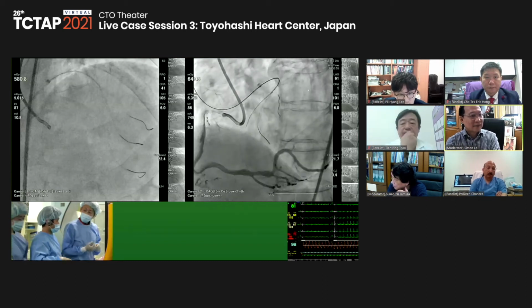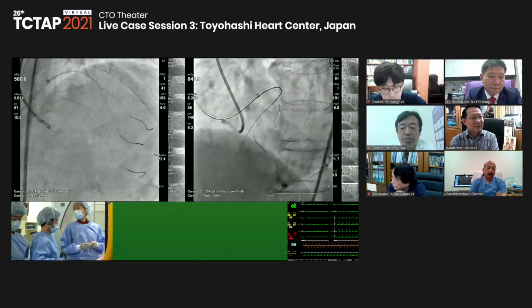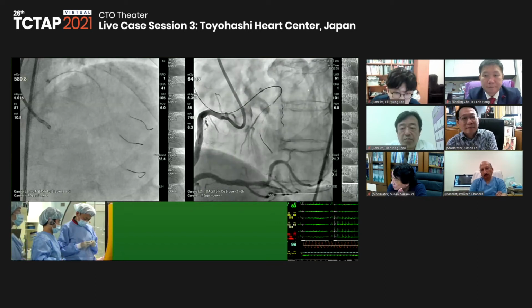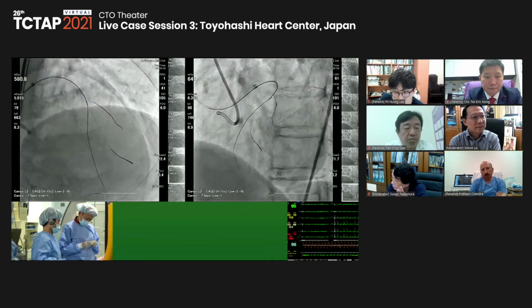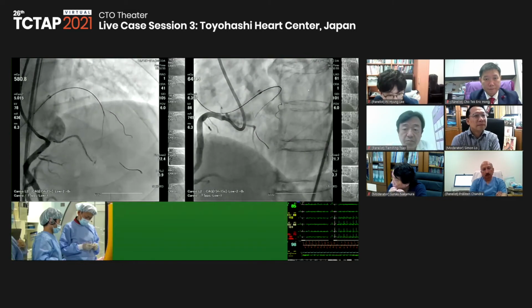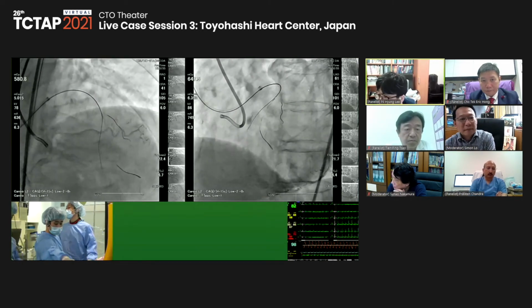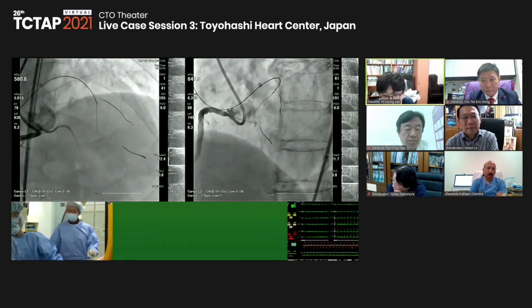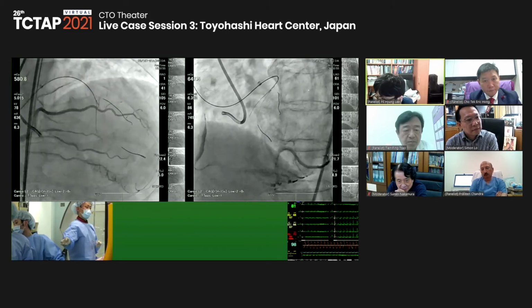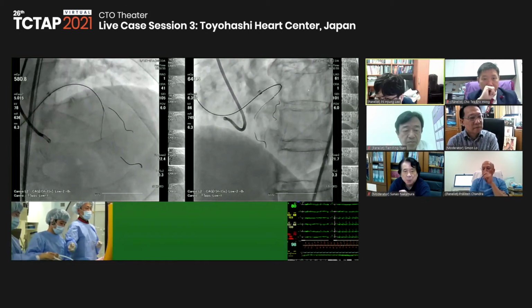I think the finding of the IVUS would be quite important because the LAD distal to the first and second diagonal was quite big at the baseline, maybe more than 3.0 or almost 3.5.